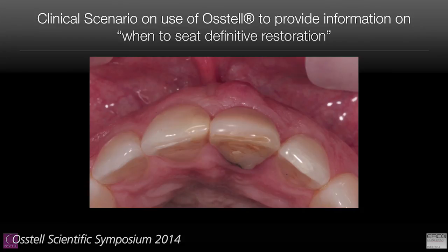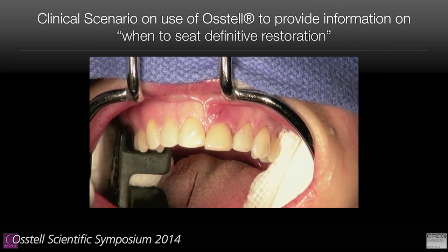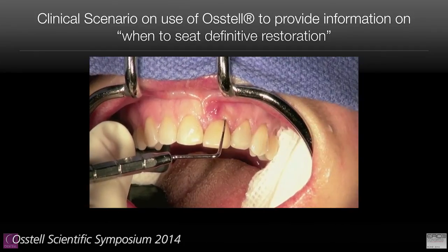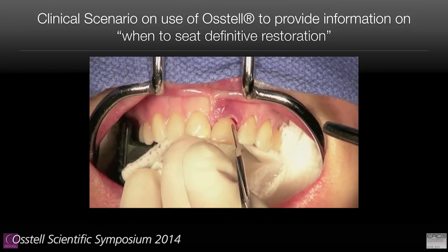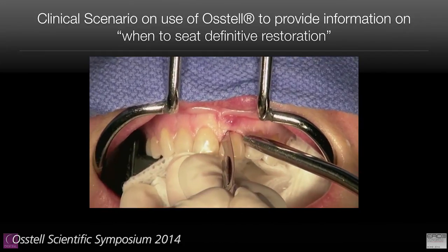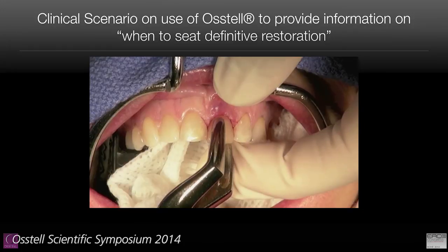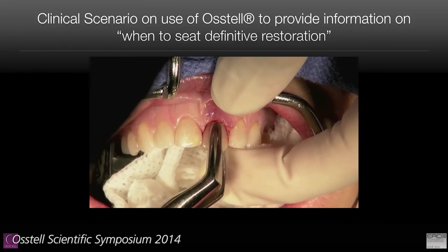And so we proceed to remove it, and not that you need to see how I extract the tooth, but the key here is identifying the osseous defect and determining how to place that implant. Because this patient is demanding, especially with the front tooth, that they leave your office with a tooth replaced. So how can you do that?